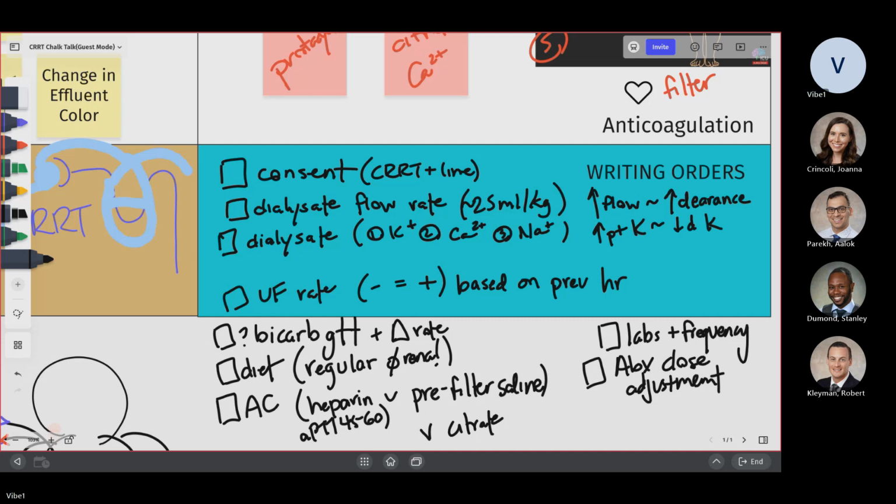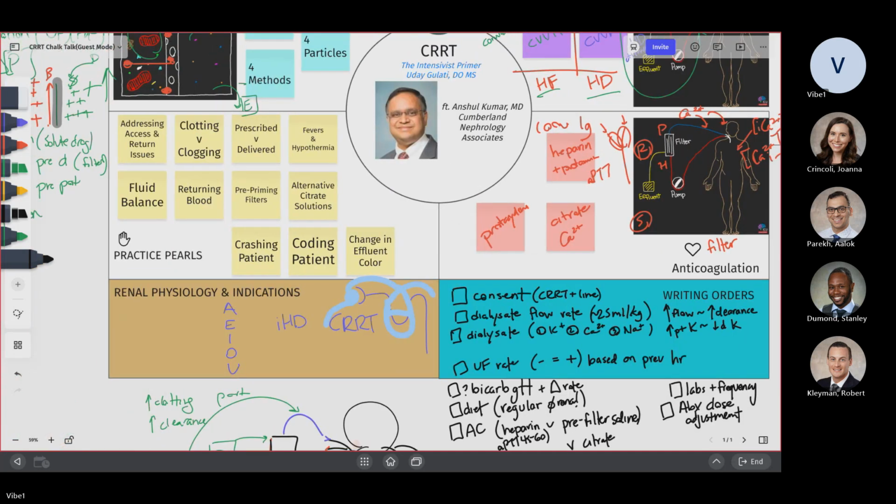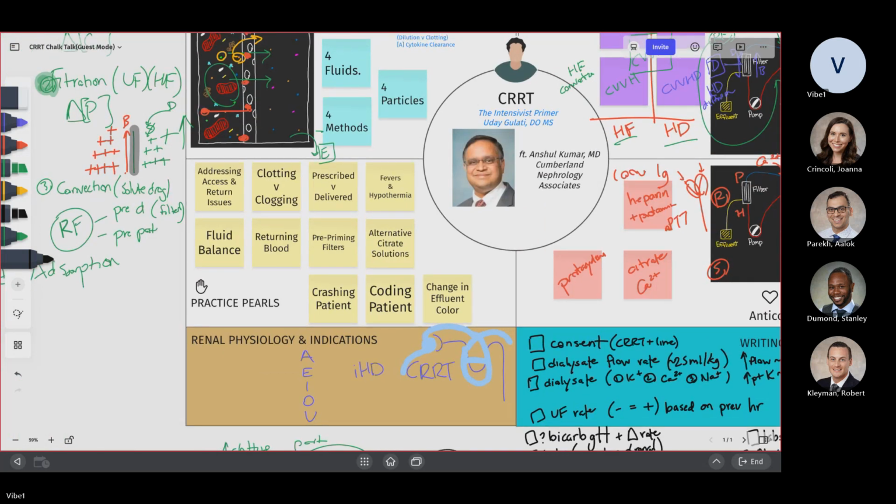Somebody comes in, has lithium poisoning. So what you do is you initially do regular HD on those patients, bring the lithium level down, but then eventually in the body, the lithium, which is bound to albumin, is going to release, it's going to rise up. So to prevent that, you can actually use CRRT to prevent the secondary rise of the lithium. But anytime remember, when you're doing this process, it's a very slow process with the slow blood flow, slow dialysate, so you're going to get very slow clearances.